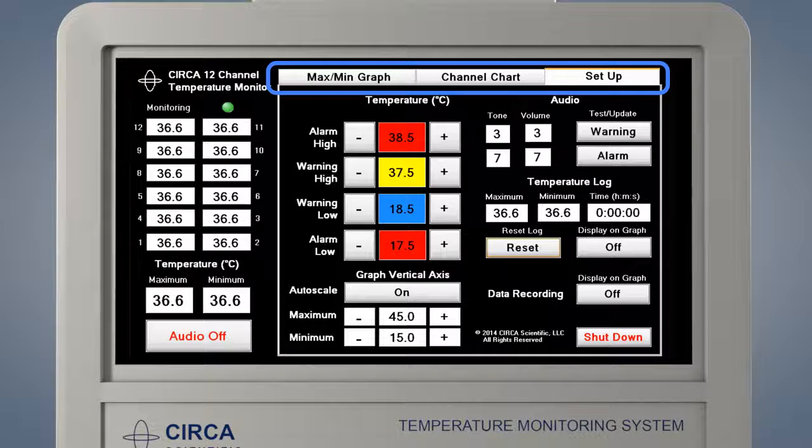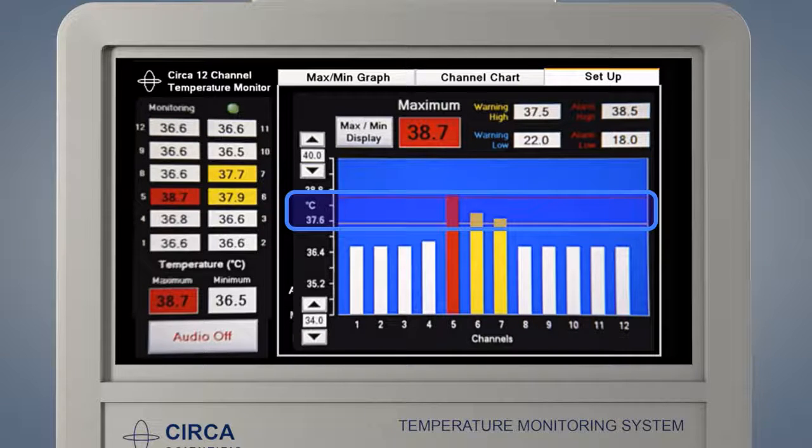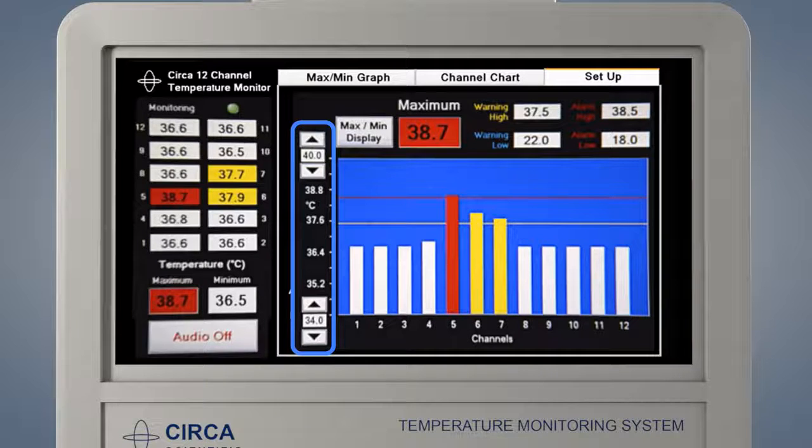The CERCA monitor has three different screens which may be navigated by touching the tabs at the top of the screen, including two screens to display temperature monitoring data: the max-min graph screen and the channel chart screen. Press the channel chart tab to display the channel chart screen. This screen displays the temperature of all 12 temperature sensors in an easy-to-understand bar graph, displayed from sensor 1 to 12. Sensor 1 is the most distal sensor, closest to the stomach; sensor 12 is the most proximal, closest to the mouth. The channel chart graph also displays the current warning and alarm settings by yellow, blue, or red lines. The sensor temperature display and corresponding bars change color as temperatures reach warning and alarm limits. The scale of the graph may be adjusted using the up or down arrows on the y-axis, and the individual temperatures are displayed numerically along the left side of the screen.